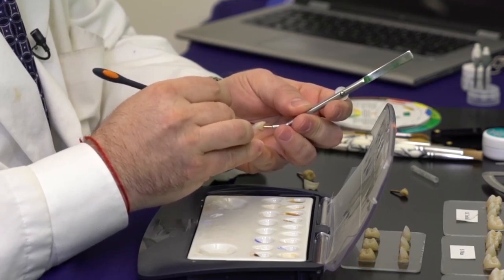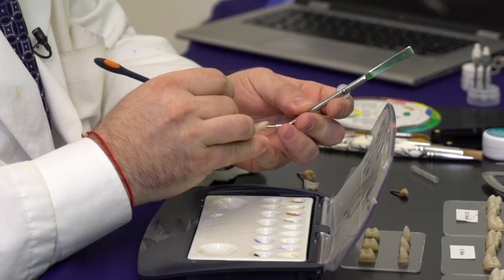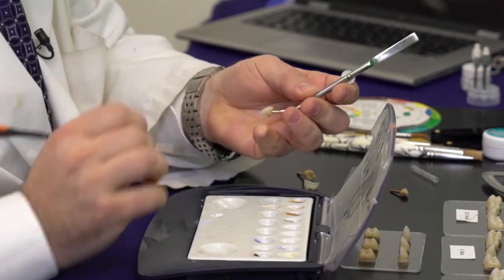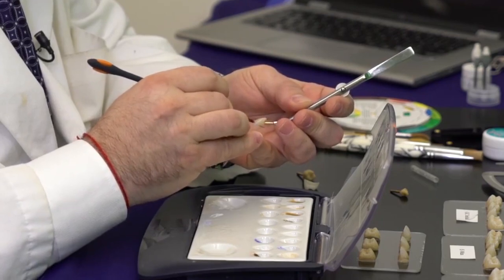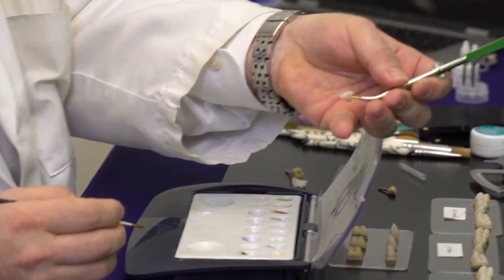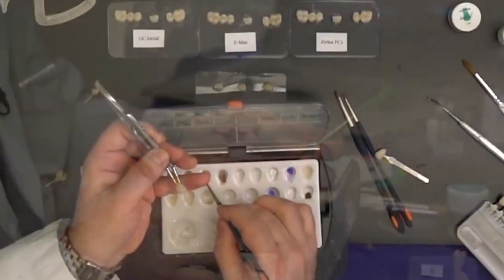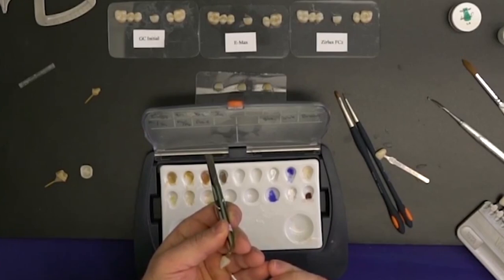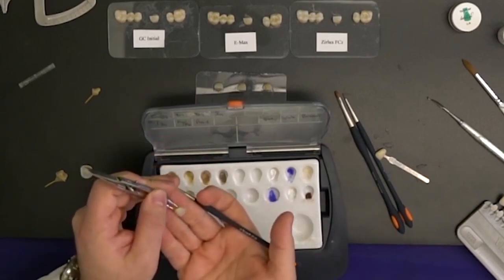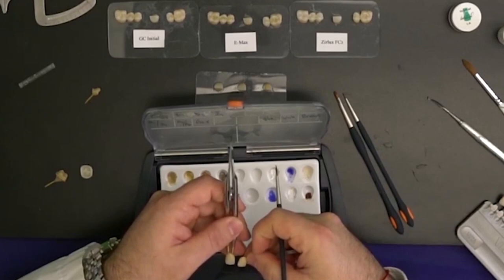The idea is to have a very thin, fine line — if it's very dominant it's going to look artificial and fake. You want it to be very faint, where it's difficult to see, but what it does is give you the look of a layered or natural tooth. Once the incisal third has that layered look, I take that same chroma and slightly layer it right at the incisal edge on the lingual side, which gives that warmth from within and really produces that layered look and vitality.